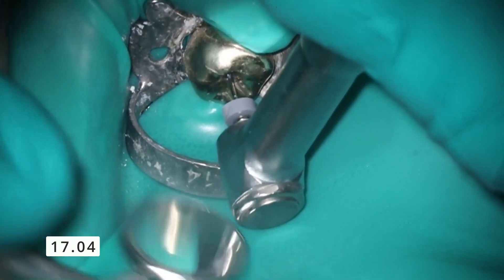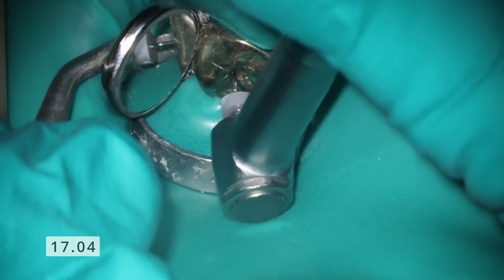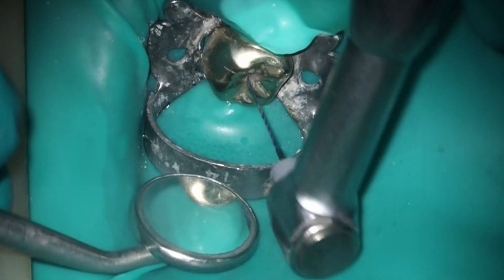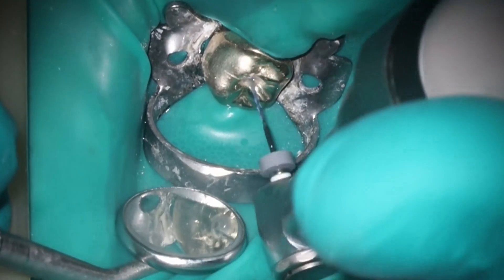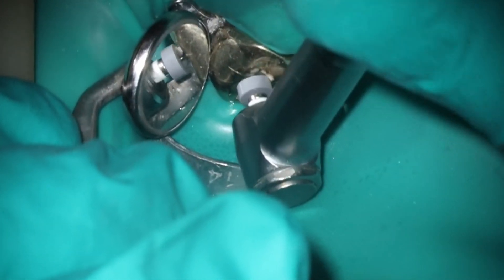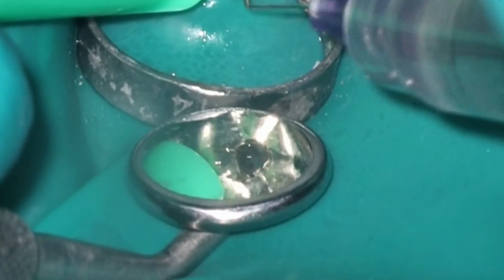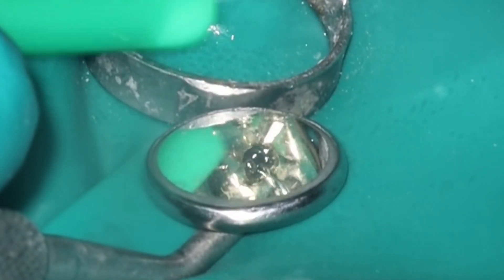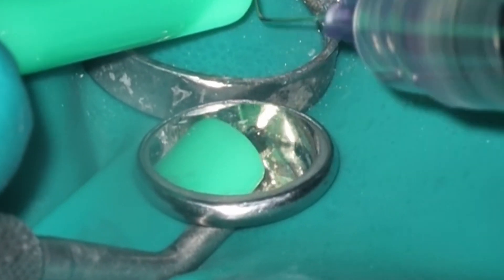You can see when I'm doing the suction, we're not getting a ton of drainage. Most of that white is actually bubbles from the Triton, from the activation of the bleach inside there — so not really any pus to worry about. Working length is normal. It took a little bit longer because you know how fun it is to get working length through gold, so I just skipped over that. I decided to shape this to a 1704. I was already concerned about fracturing it — no need to remove any excess tooth structure here, especially on those mesials. They are nice and skinny and curvy. Getting down to my working length took a little extra time with the calcification, but we were able to keep things nice and tiny as far as our access — very small and minimally invasive, which is what we strive to do with all of our cases here.